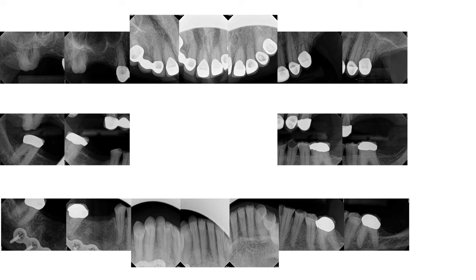Just to give you a little more background, this set of CMS has been imported from an outside doctor's office. It was taken with a sensor along with a round collimator. This is a type of technique error that we don't normally see at our school. You're seeing rounded cone cut images.